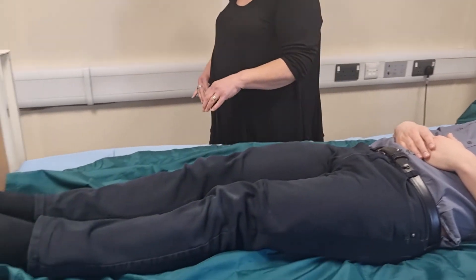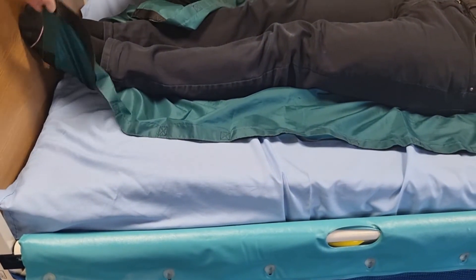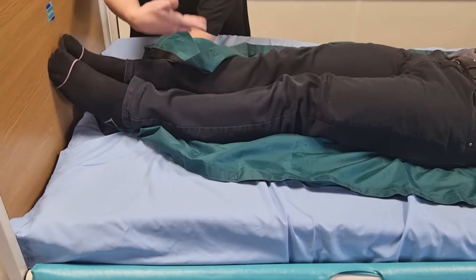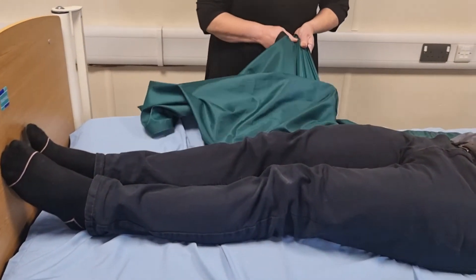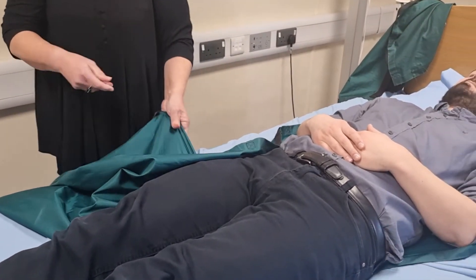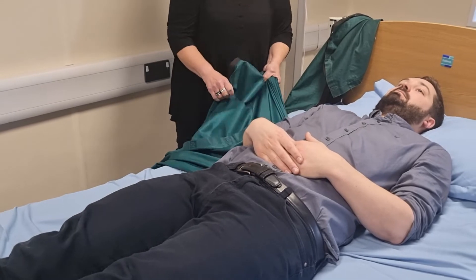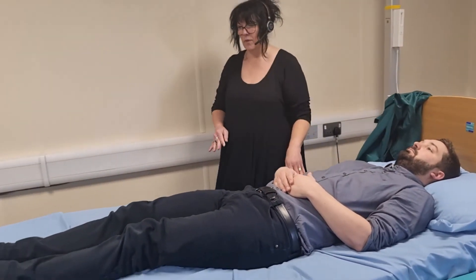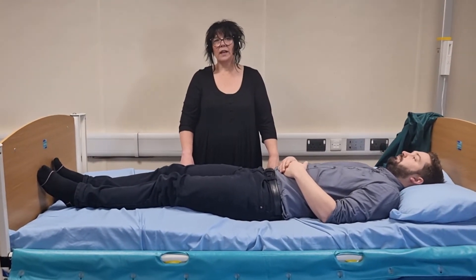Then we do the exact same thing with the remaining slide sheet — bottom corner under itself, folding away from the person's skin, and we pull that opposite corner. And that's the fitting and removal of two flat slide sheets.